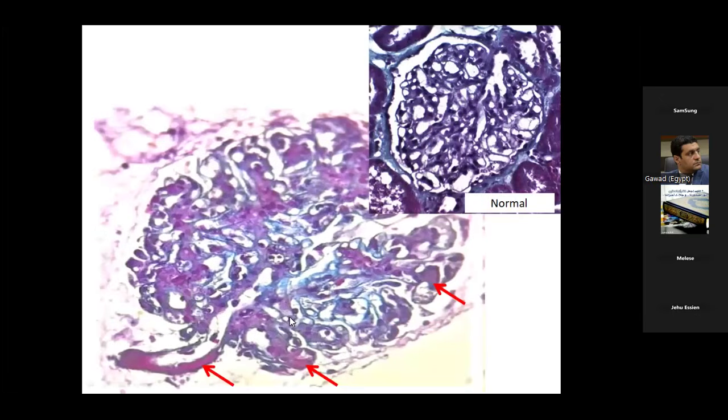Let's see this case. It was for an HCV patient with these refractile deposits, and that's what we mean by refractile. It's clean, with subendothelial deposits and a very well formed inner and outer surface of this arteriole. And another deposit here is mesangial. When we compare with the normal, this membrane versus this membrane, and versus the previously seen hyalinosis, that's very different from hyalinosis.